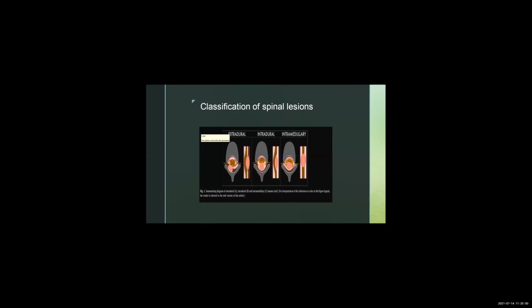The X-rays, the reason I think we still use X-rays is because it's cost effective, and in terms of safety, it's much lower radiation. So MRIs are expensive. They're powerful magnets. They can take a long time. A lot of people are uncomfortable because they get claustrophobic, because they're in this very tight space. It's very noisy. And it is pretty resource intensive, especially across the world where not every country has the same amount of resources. And I'm saying that because I know I'm speaking to a global audience.